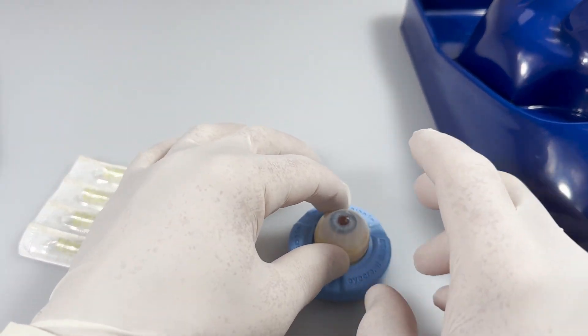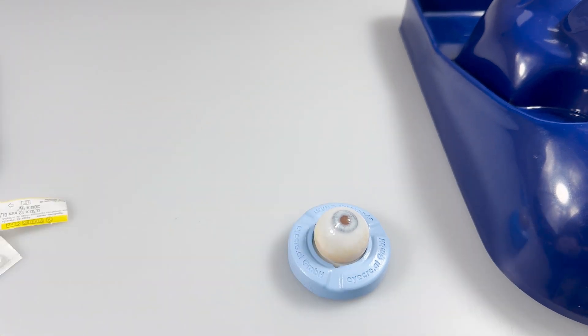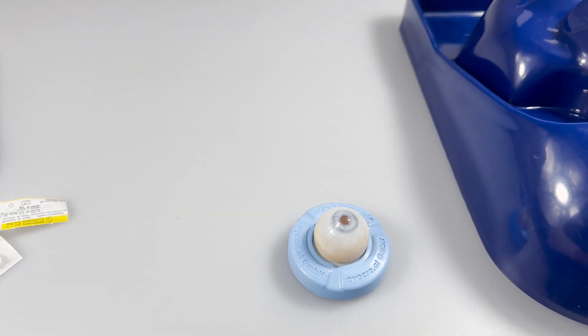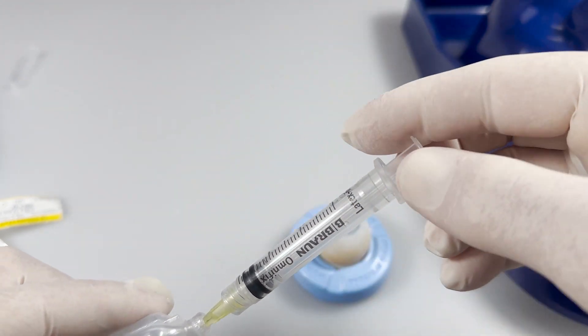So in this case I just show the injection, how it reacts. I use a 30 gauge needle, a small syringe. Put some liquid into the syringe.